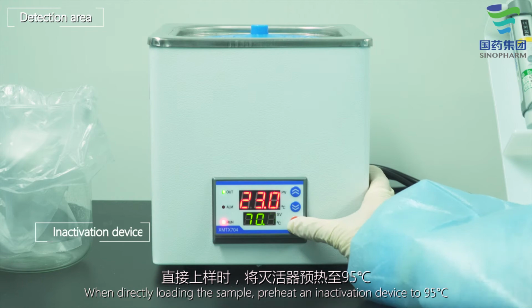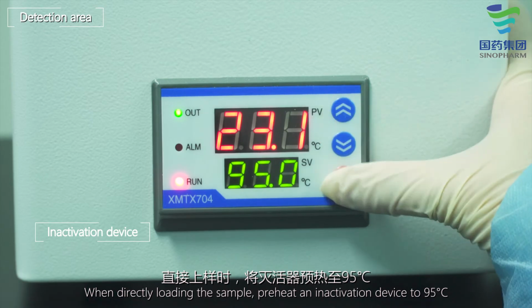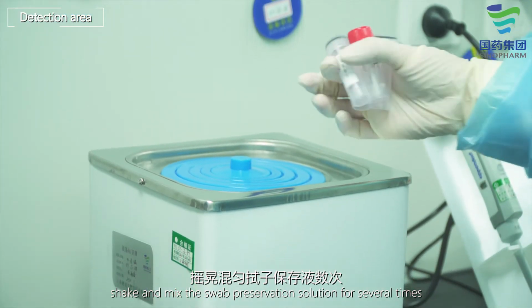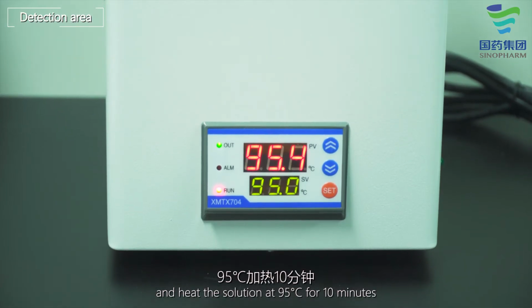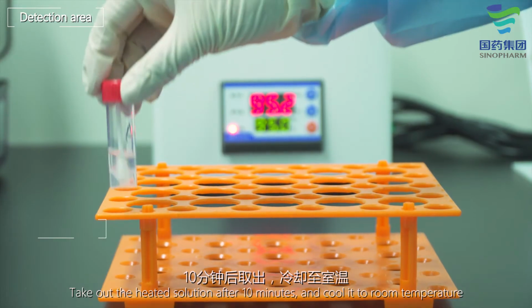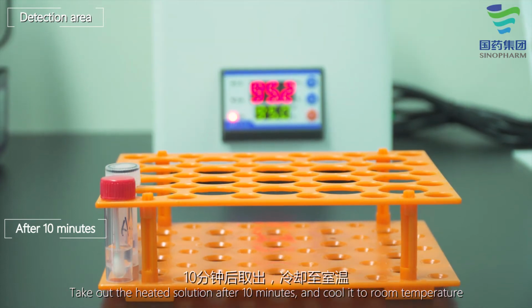When directly loading the sample, preheat an inactivation device to 95 degrees centigrade. Shake and mix the swab preservation solution for several times. Place it in the inactivation device and heat the solution at 95 degrees centigrade for 10 minutes. Take out the heated solution after 10 minutes and cool it to room temperature.